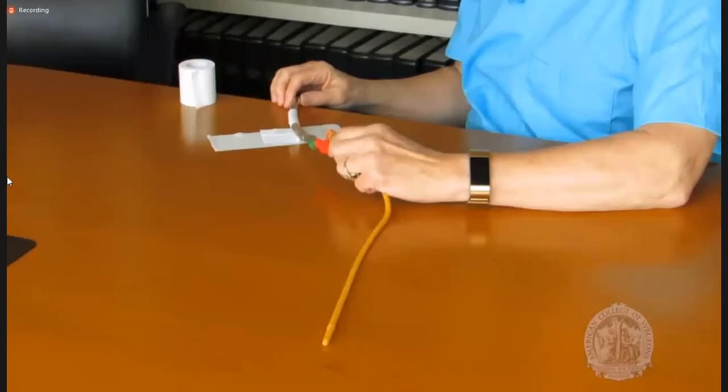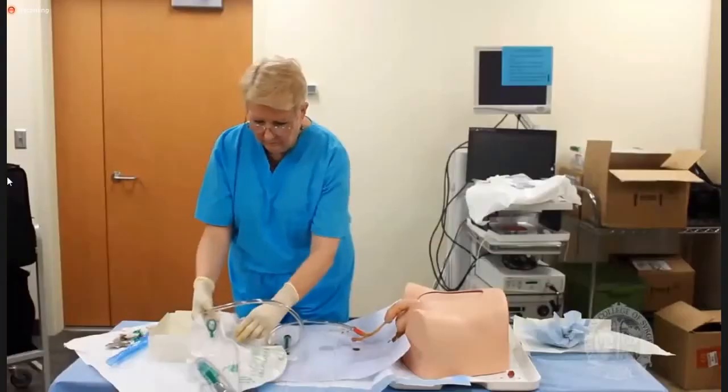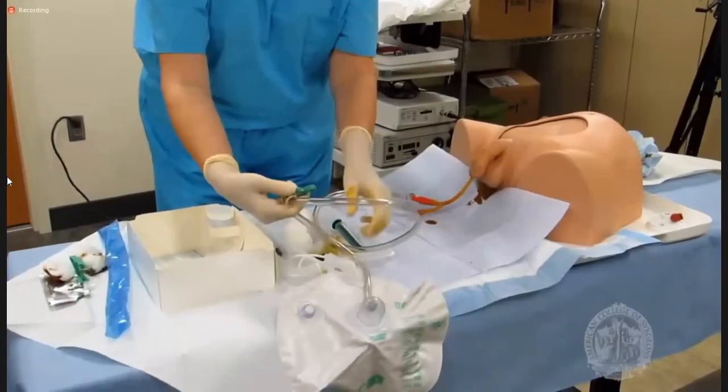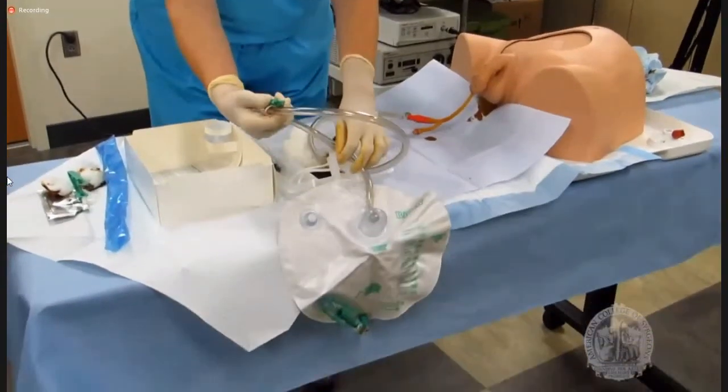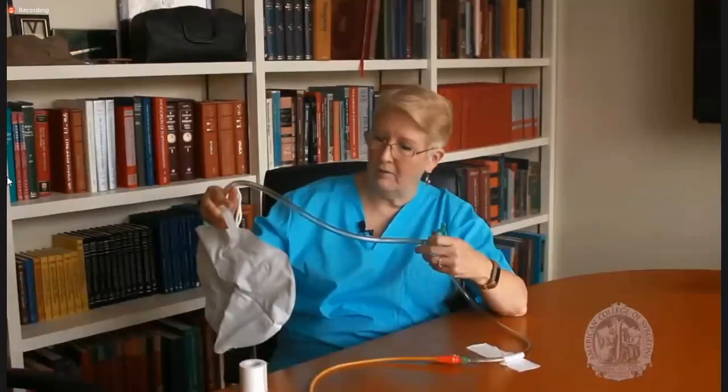Whether using tape or a commercial stabilization device, leave enough slack in the catheter and tubing so there's no tension on the bladder neck. The tubing can then be clipped to the sheets or the patient's gown. The bag should be placed in a dependent position and never above the bladder.